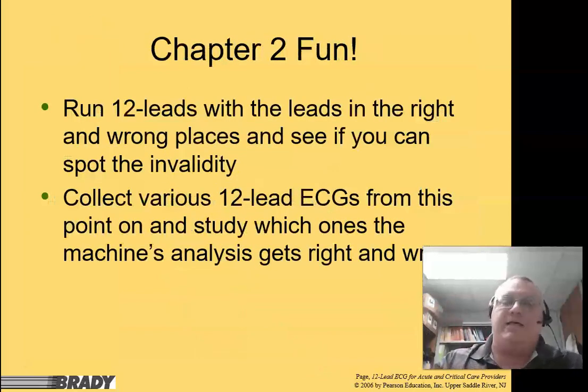Now that's going to end it for this. Again, these are little tips and tricks that I hope will help you understand that you've got to make sure you're doing the right things. You've got to make sure your wires are on right. And there's that little calibration box. So hopefully this will help you read your EKGs a little bit better.